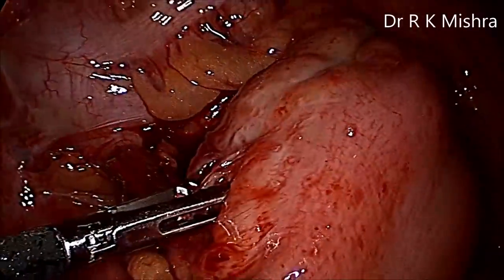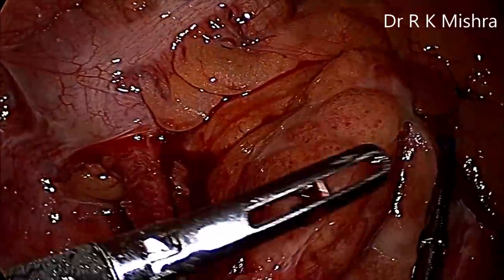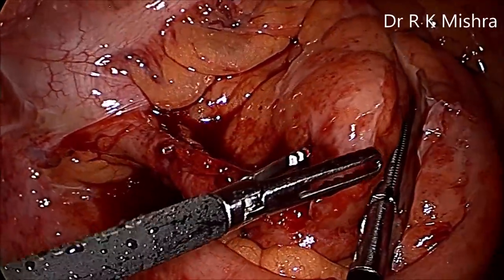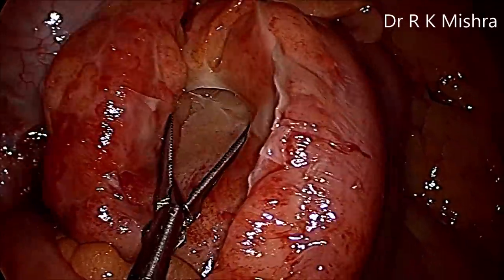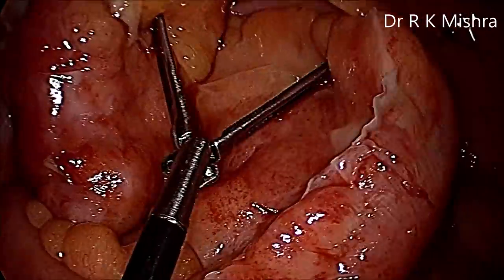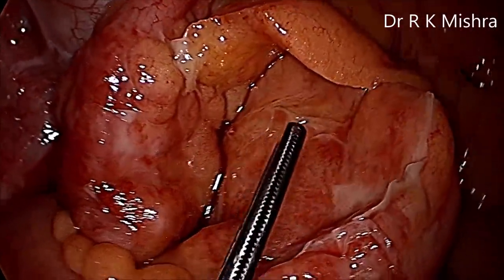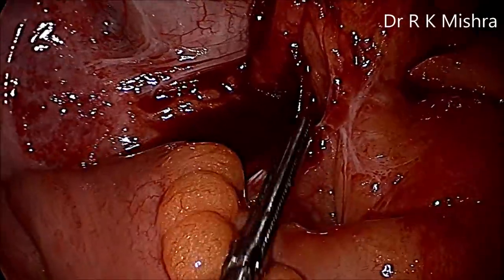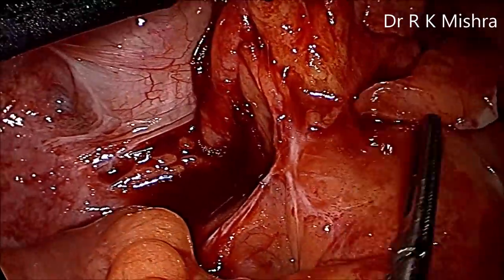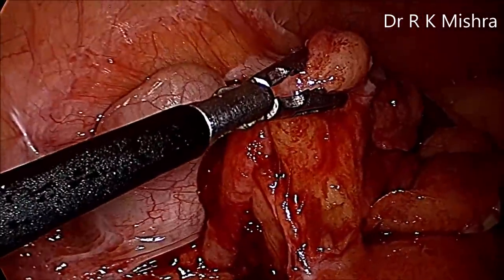You can see the left side is the appendix and the right side is the small intestine. With the atraumatic grasper, the appendix has been separated from the small intestine. You can see it looks like a fecolith, with a lot of swelling. It's completely thrombosed. If you do not operate within a few hours, it may get perforated also. So this is separated. Now we will hold it with a semi-traumatic grasper, lift it up and go to the base. At the level of the base also, there is a lot of adhesion and inflammation. So the mesoappendix can be separated with the harmonic scalpel in those situations.